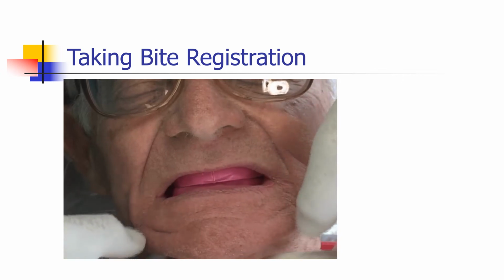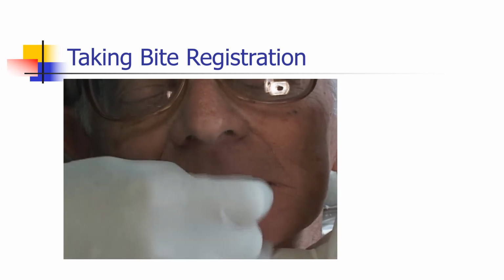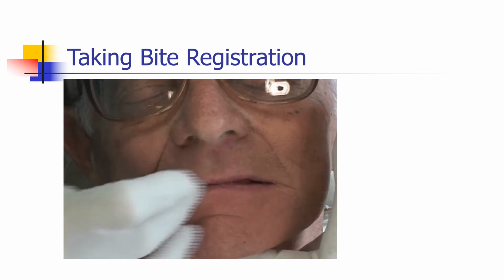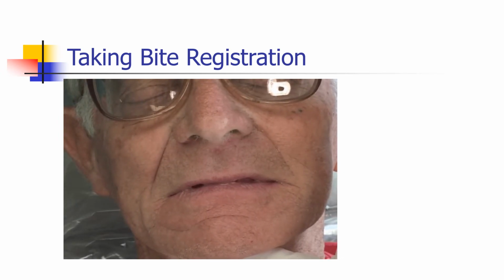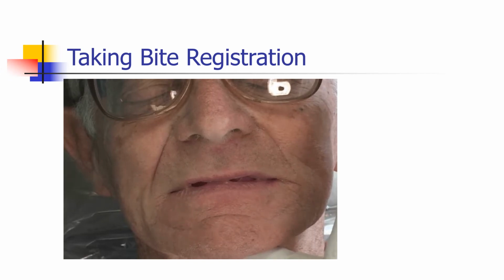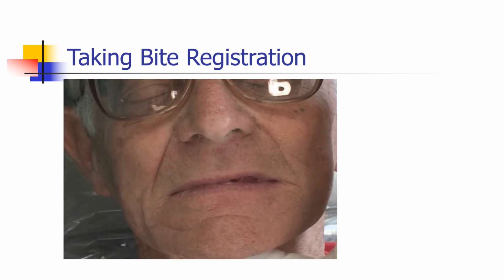The way we determine the vertical dimension is to have the patient totally relax the lips, and we want the lips to just barely touch. Interesting enough, we did no adjustments on this whatsoever, but because we set the lower bite block midway to the retromolar pad, we got this right on the money right off the bat. His lips just barely touch. That gives us the maximum bite opening possible.